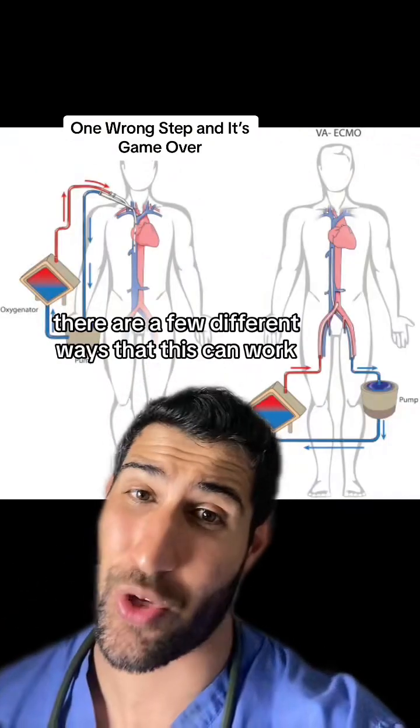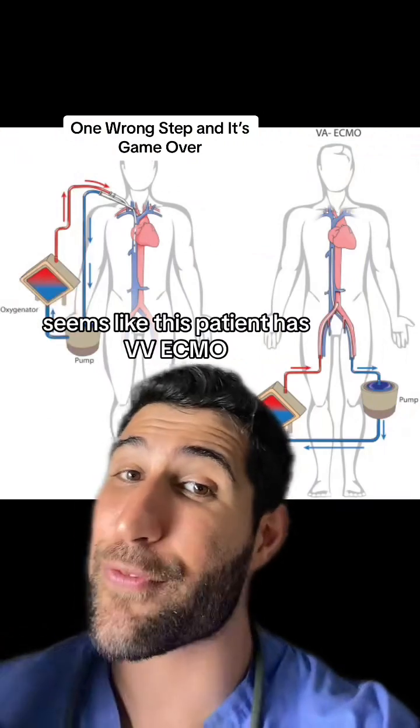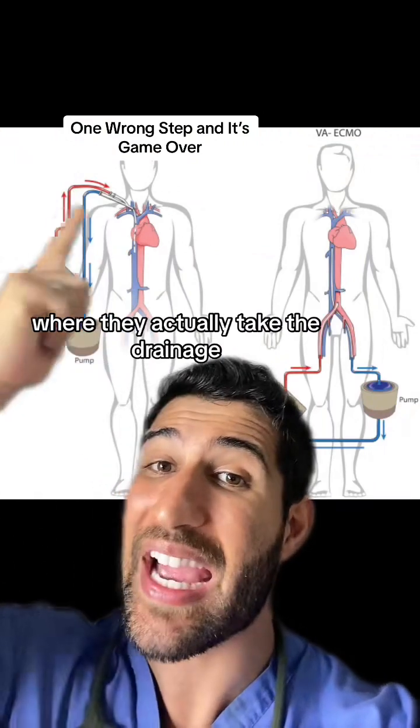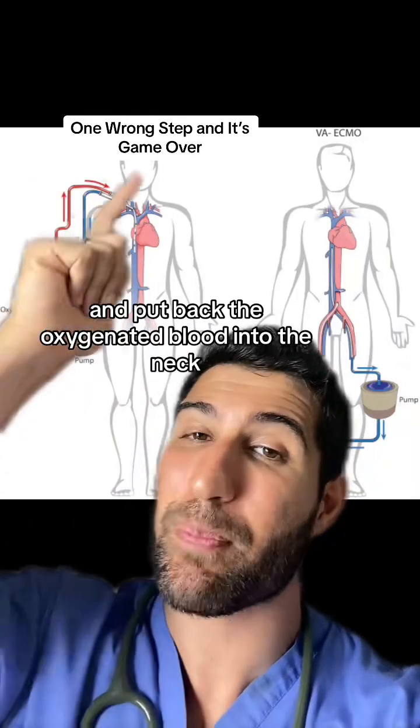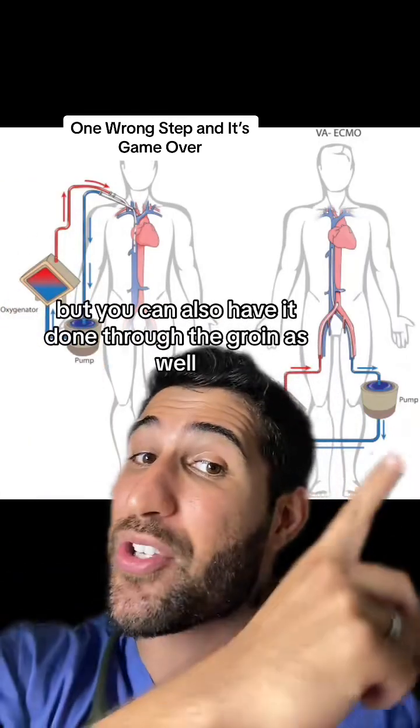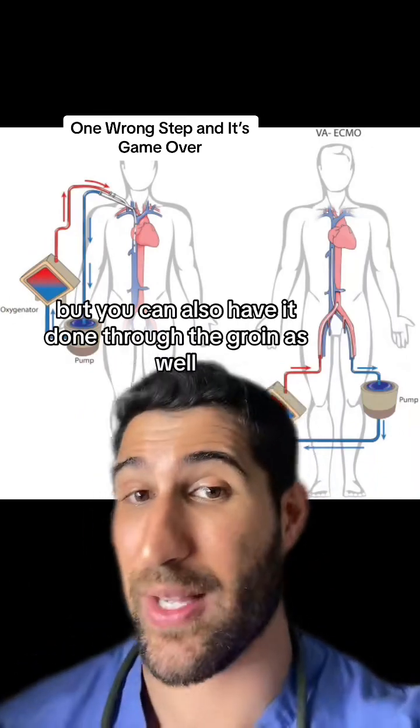There are a few different ways that this can work. It seems like this patient has VV ECMO, where they actually take the drainage and put back the oxygenated blood into the neck, but you can also have it done through the groin as well.